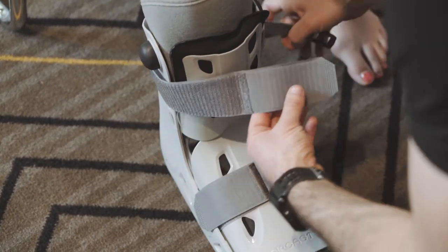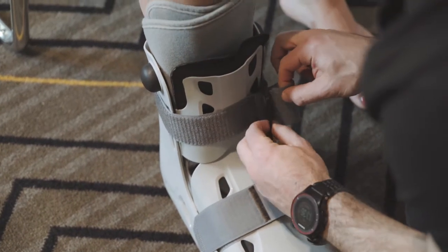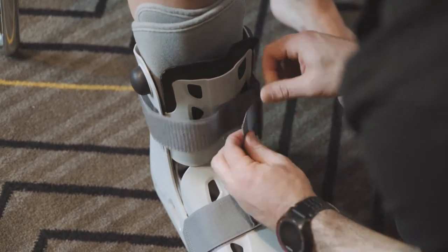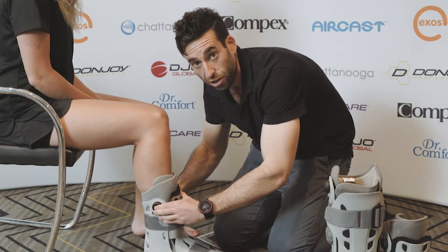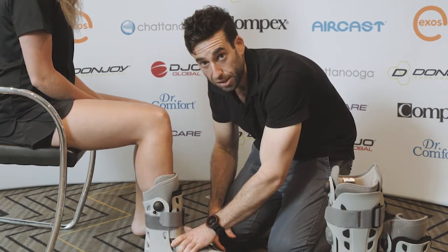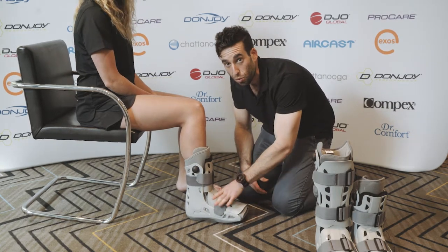It needs to be secure without being too painful. The beauty about the air cast and the reason I use it is that you've got the pressure gauges on the side, so as opposed to other boots the patient can actually add enough pressure so they feel some comfort and support around the ankle site. It'll be up to the patient to determine how much support they need.